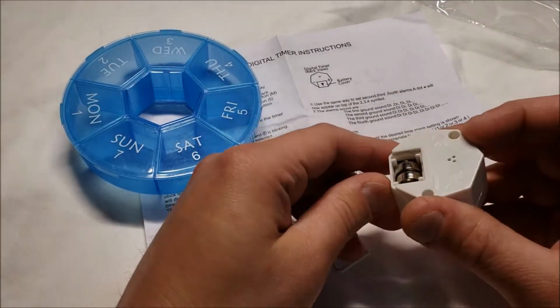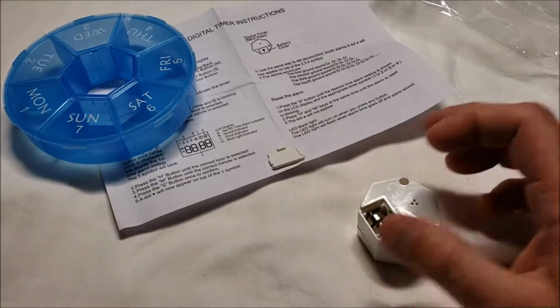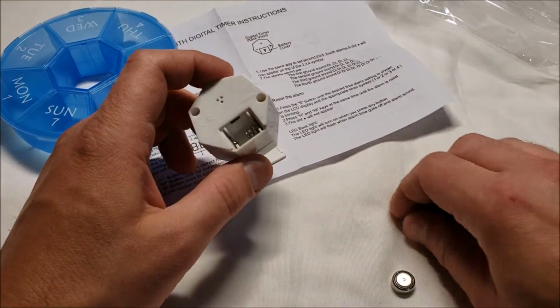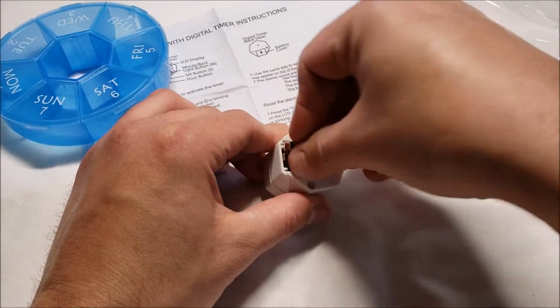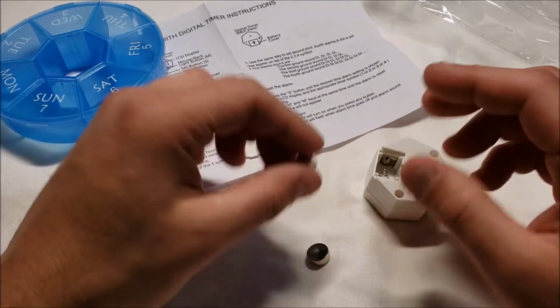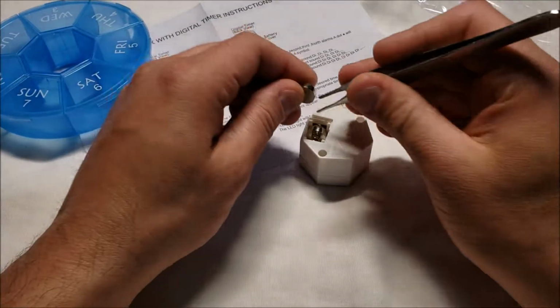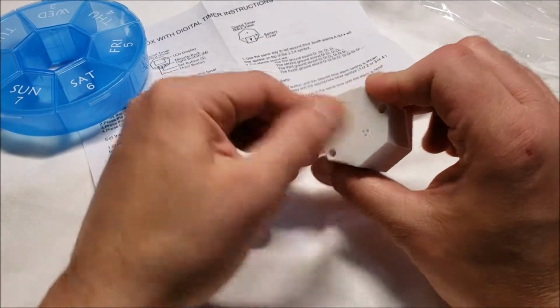Let me see what's going on here. What's up with this guy here? Let's try this. What was that? Okay, maybe not. I thought sometimes there's a little paper spacer in there to keep the batteries from activating. Wow, okay. They're not easy to get in, as you can see. So I would not advise taking them out, unless you really have to, which I don't think you do. Alright, let's try this again. Let's pull this on there. Okay, there we go. Now, I heard a beep.